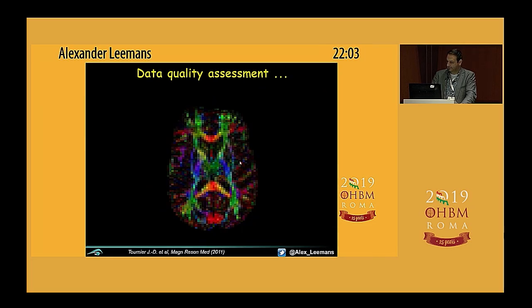This one over here. Anything abnormal that you can see? Well, it might be difficult, but remember the color encoding? Red means left-right. Bright in the image means high FA, which means a highly structurally coherent tissue organization that underlies the diffusion.